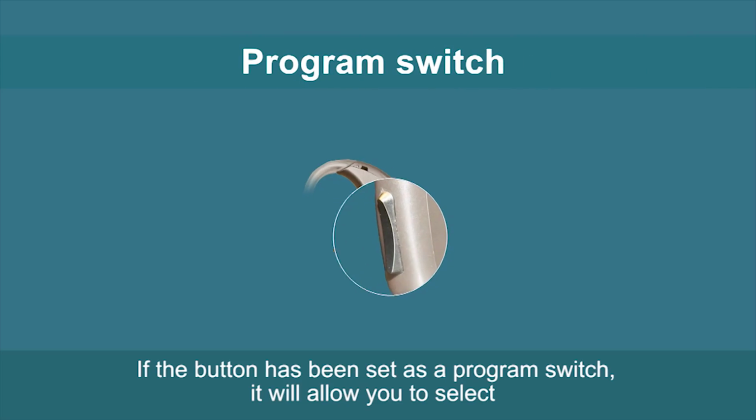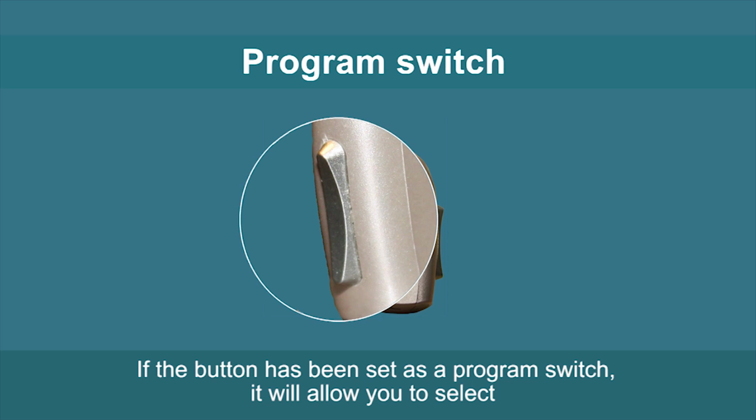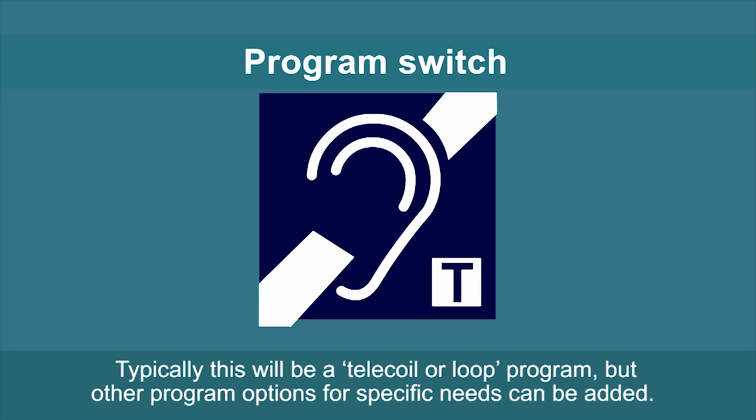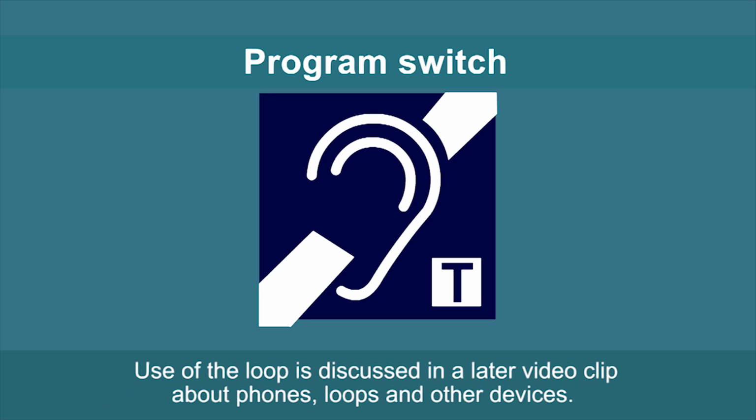The program switch. If the button has been set as a program switch, it will allow you to select any additional programs that have been activated by an audiologist. Typically, this will be a telecoil or loop program, but other program options for specific needs can be added. Use of the loop is discussed in a later video clip about phones, loops, and other devices.